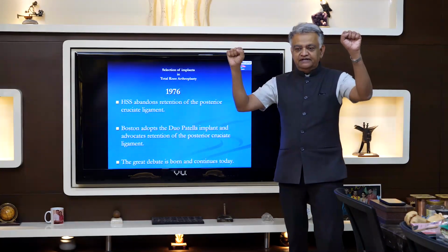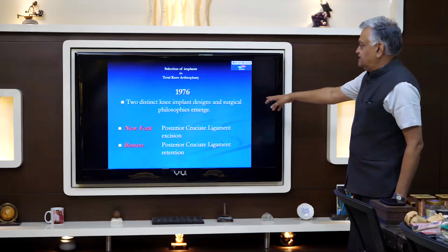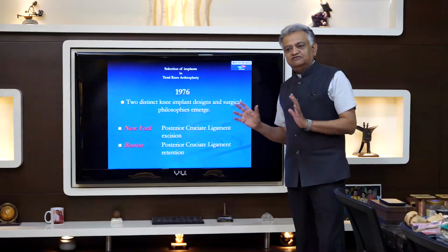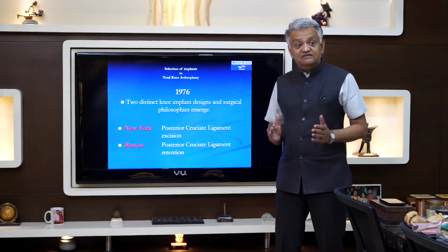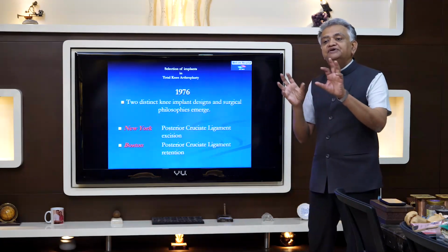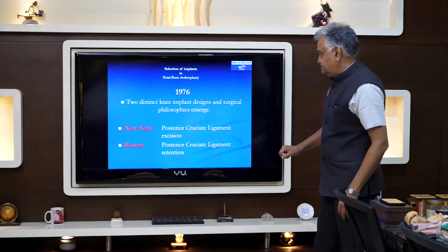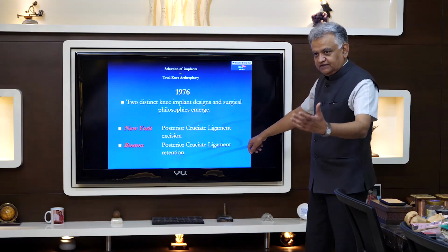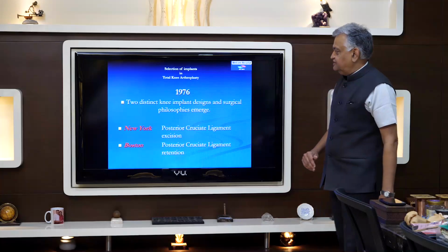Should we or should we not retain the posterior cruciate? Next, please. So, two distinct knee implant designs and surgical philosophies emerge. And now, if you have understood this up to now, this is where the actual core of today's lecture is, as far as selection of implants is concerned, and then onwards. But it had to be put into perspective how you reached this, the great debate, whether to retain the PCL or not to retain the PCL. So in New York, PCL excision was there. They took that as their philosophy. In Boston, PCL retention is what they took as their philosophy. Next, please.